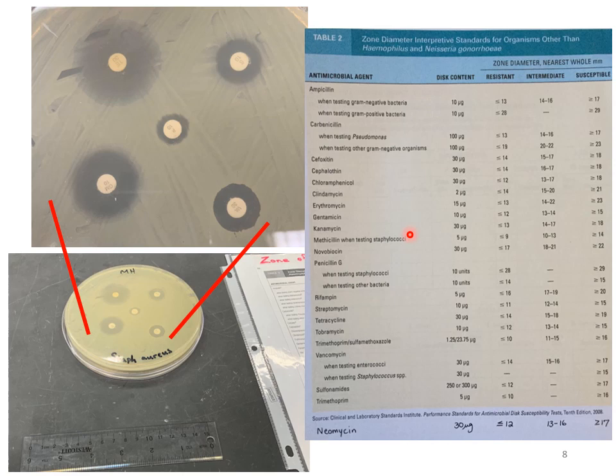Okay. You then look at the next one, vancomycin. You would go to vancomycin and measure this diameter. Let's say it's 18 millimeters. You would go vancomycin, when testing Staphylococcus, go across. 18 is greater than or equal to 15, so Staph aureus is susceptible to vancomycin in this case. Okay, so we would use the chart.